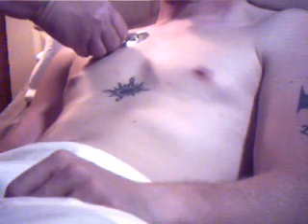Palpate the second rib and check the manubrio-sternal angle. They should coincide. Now, locating the right second intercostal space, move to the border of the sternum. This is the location of the aortic valve. Listen with the stethoscope.